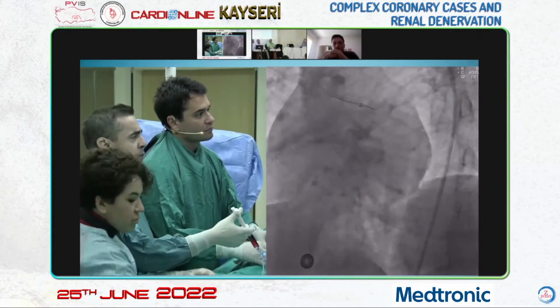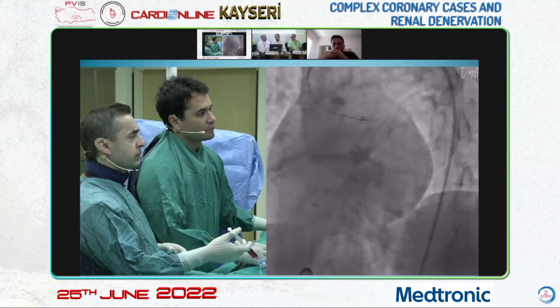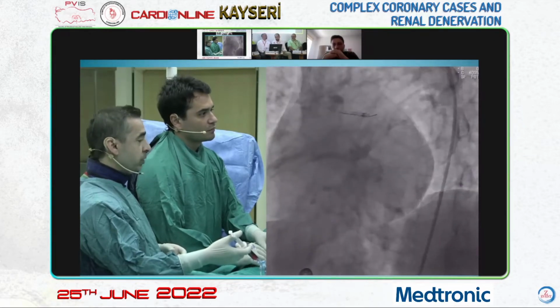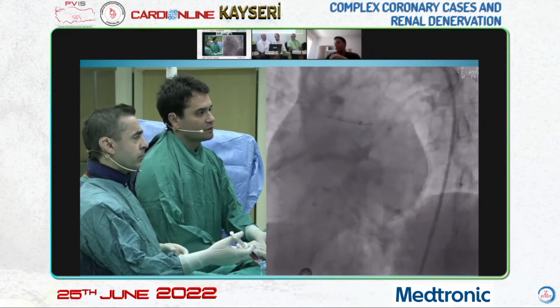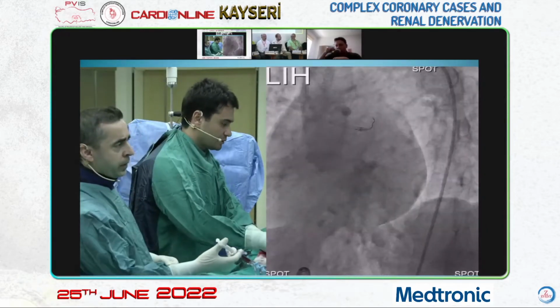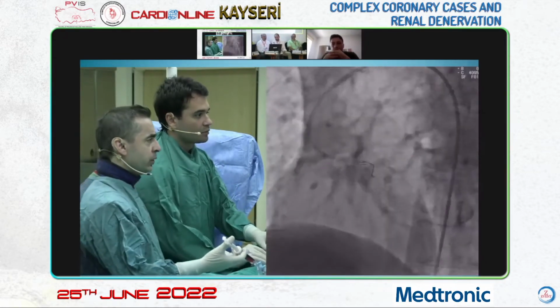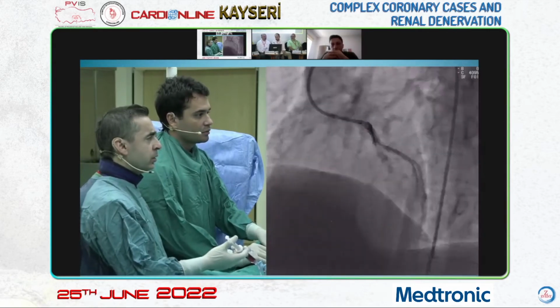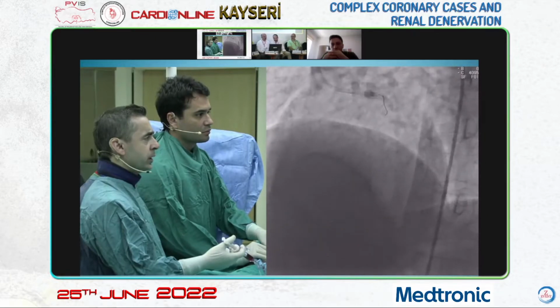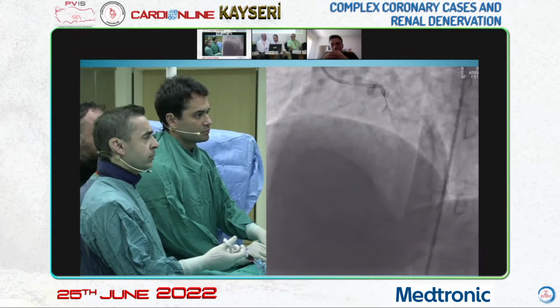Murat, would you say something? No, like Nihat Hussein started from the later stage. What was your approach instead of saying the CTA? The wire selection is very important here. I am the moderator. Let me not talk, but I give the floor to you. Just looking at the lesion, wire selection is very important here. Well, in the same manner, the wire selection is very important.